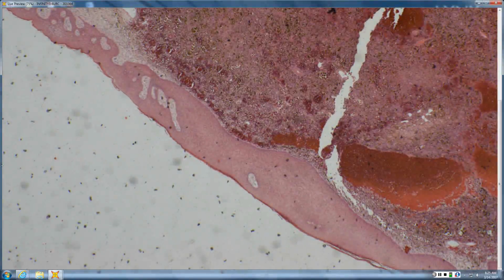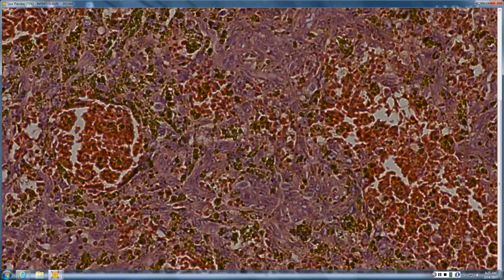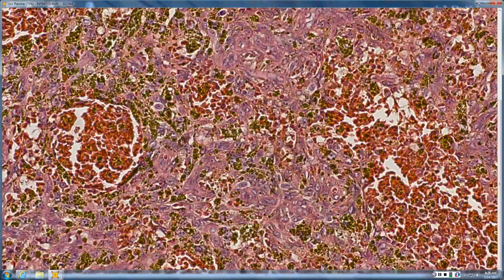Any clues? Epidermis is a clue. So tell me about the clue in the epidermis. It's the acanthosis. Melanoma tumors are less acanthotic, where you have more of a slam dunk. And then you look at the brown stuff and flip down your condenser, and it twinkles at you and is refractile, so it's not melanin, it's hemosiderin. And so lots of hemosiderin in a DF, really common. Overlying acanthosis, well done.